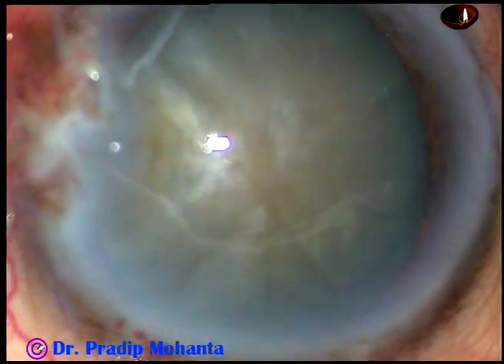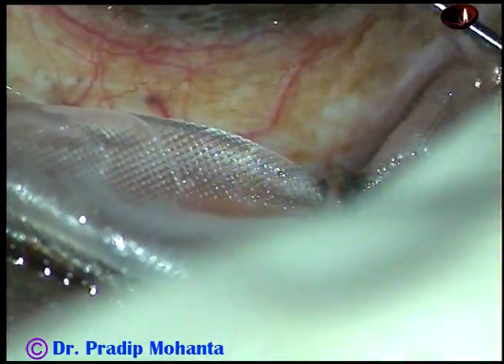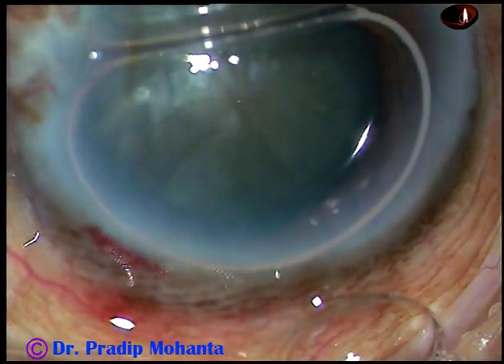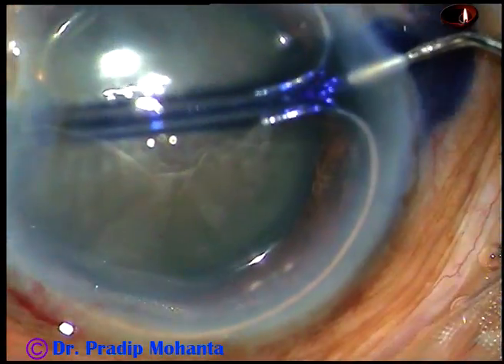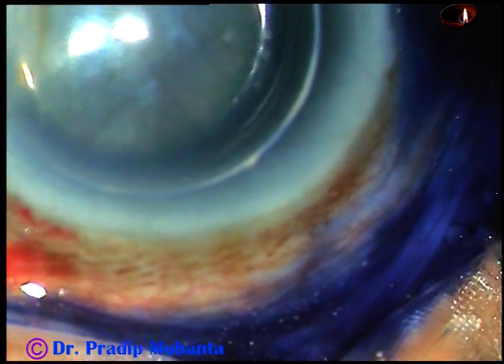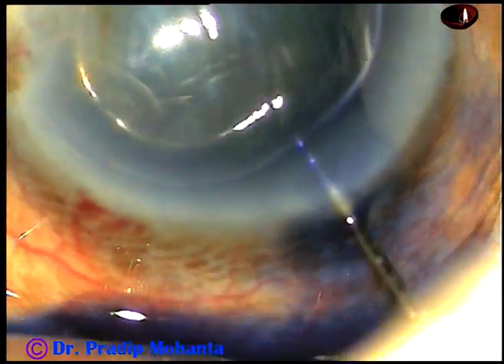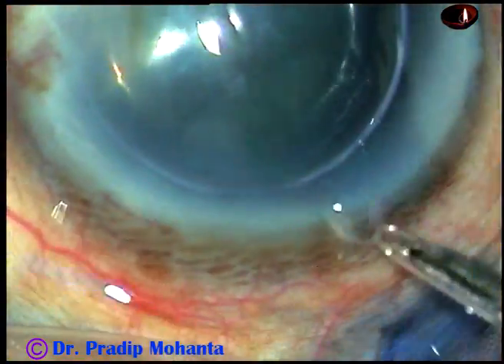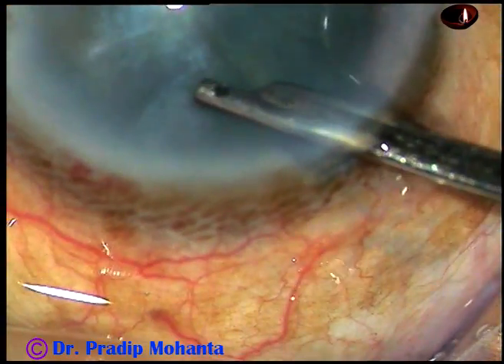Now an air bubble is injected into the anterior chamber. I prefer to stain the anterior capsule with trypan blue dye underneath an air bubble because the dye is not diluted by aqueous humor. When it is applied underneath an air bubble, the staining is very nice in a very short time. So the dye is sprayed evenly over all parts of the anterior capsule and then the dye is washed out with BSS.